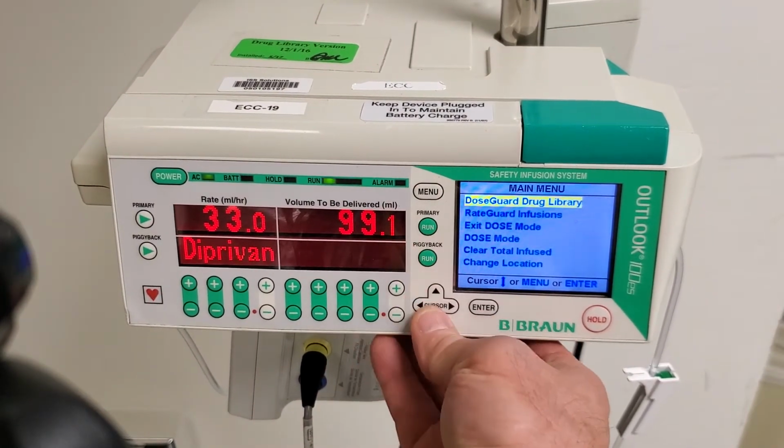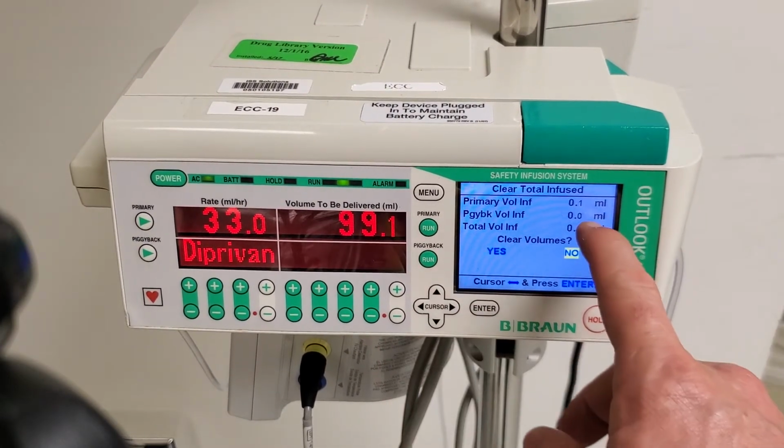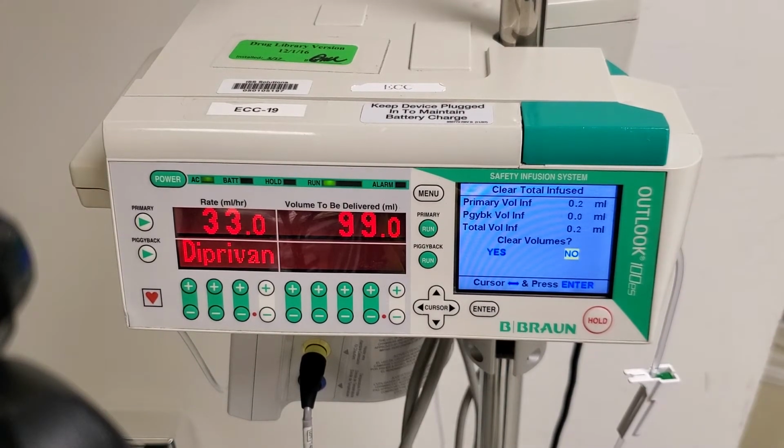Now notice that it is all at 0. So you pick up the patient, you document how much has been infused, and then you clear it so that when you arrive at the receiving facility, you can look and see how much was infused during your transport. This is especially helpful with narcotics like fentanyl and Versed, where you need to document waste.